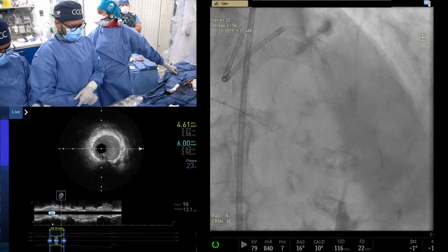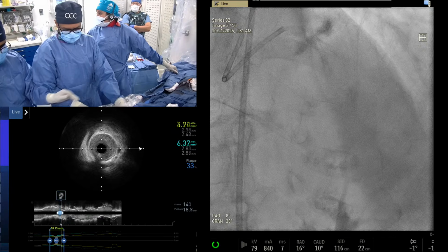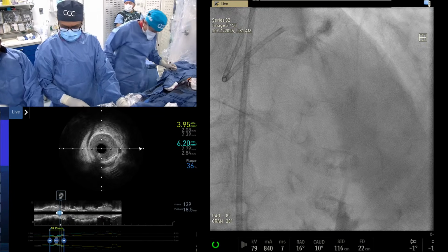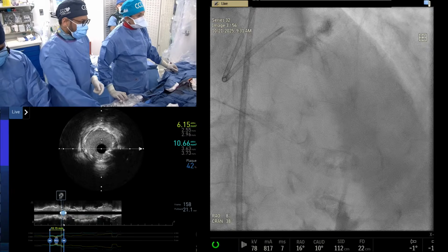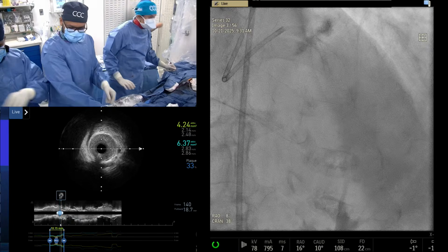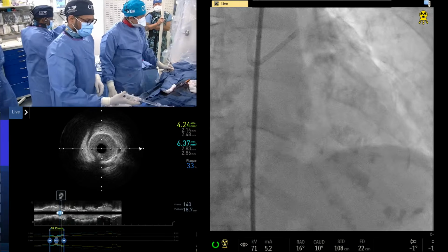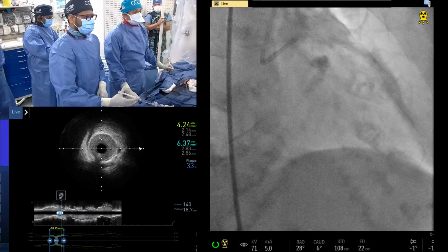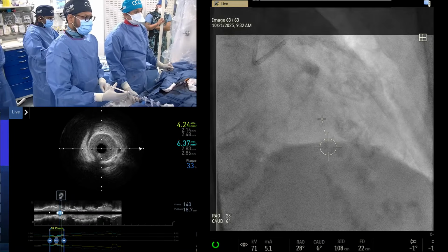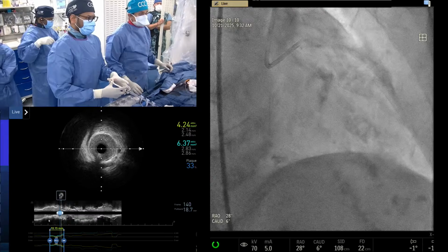No, but tell us, people talk about some arc like 70-degree arc, and 2 millimeter in length. OCT. Yeah, but still the same criteria may apply here because you have the dissection width, or arc of dissection, which you are worried about. I don't think it's come to the media. So like intimal dissection and the flap, almost 90 degrees. So actually the cutoff is 90 degrees. Really? So 90, okay. Kind of borderline. I see.